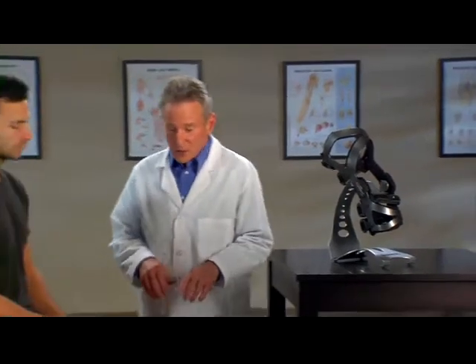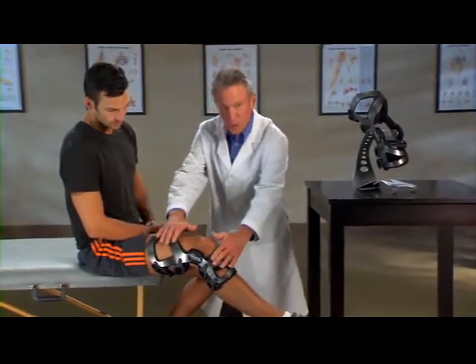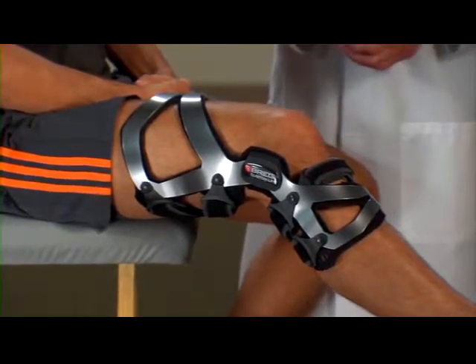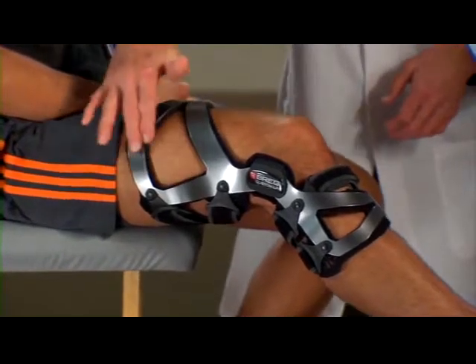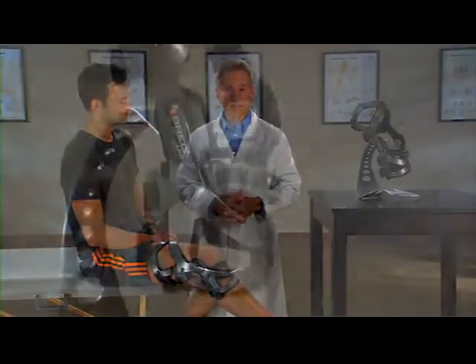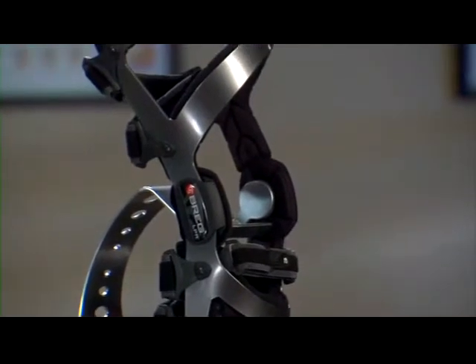Here's why. First, there's the brace frame. You can see how it's contoured to hug the leg — you don't see any gapping or pinching. The brace's truss frame — these angles here — provide structural stiffness and strength. The frame is actually made from aerospace aluminum, making it strong yet lightweight.